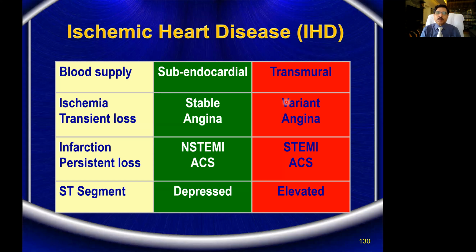Today, you know so much about Prinzmetal angina, so all of you are probably familiar with it. This is a vasospastic angina. There is ischemia only, no injury and infarction. The blood supply is transiently cut off, and what we see is that the entire thickness is affected. So we see an ST elevation, which returns to normal with treatment. The treatment of this angina is different from the treatment of the other angina. In fact, what we give sometimes, we should not give here. I'll tell you about that.